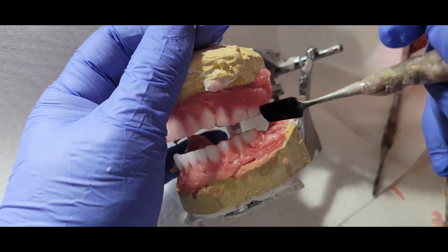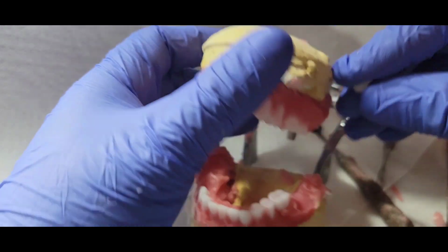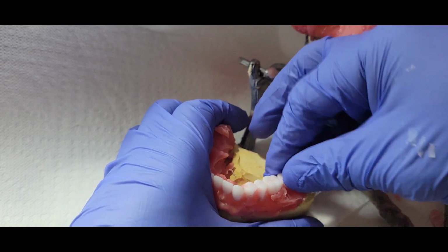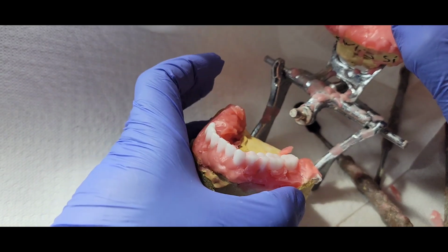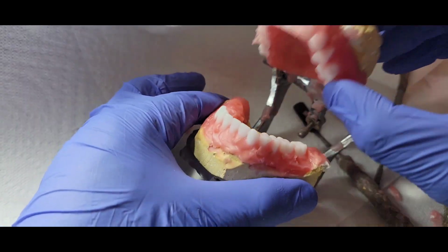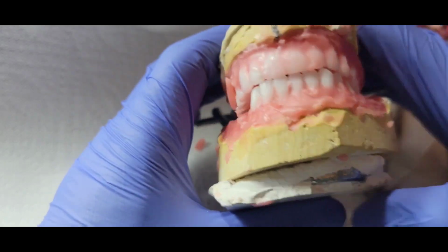As I was saying, this is my last tooth right here. I just press down to dig into the wax, you know. The reason why those teeth stay put is because you are pressing, you are using wax that acts like a glue. You see how tight the occlusion is?